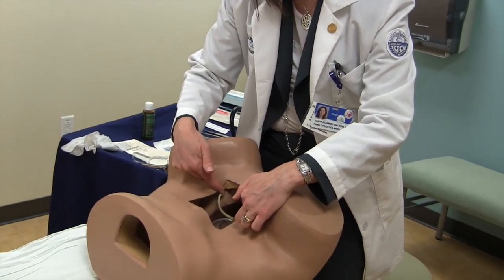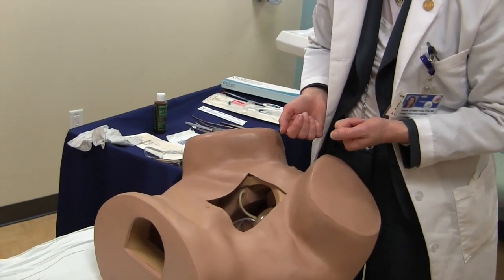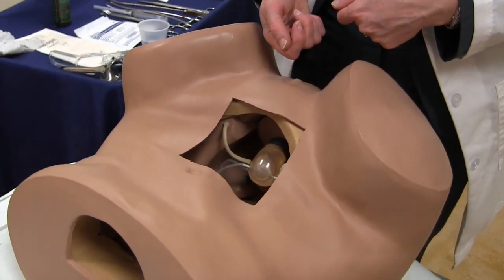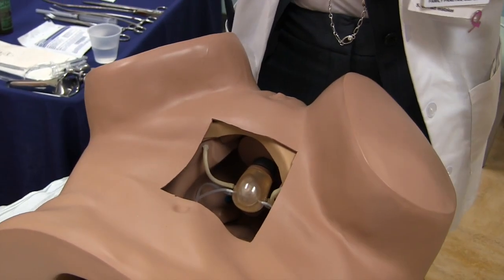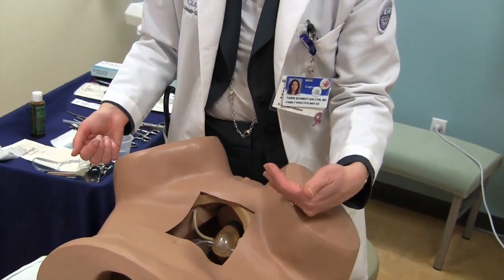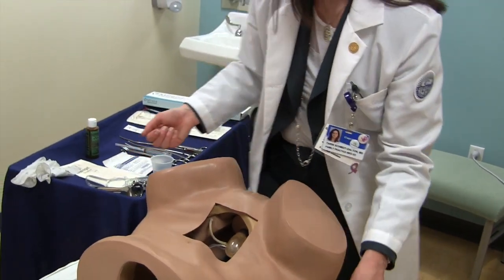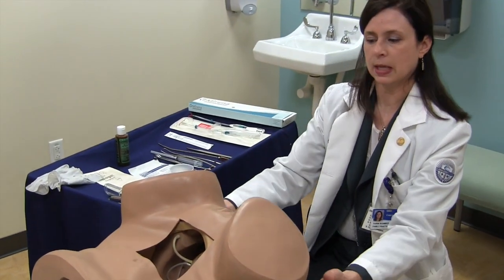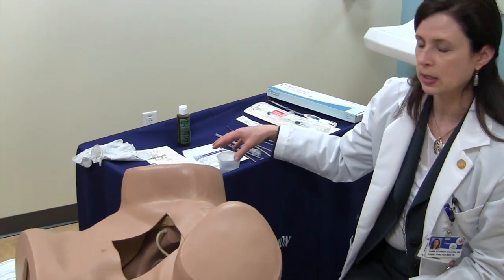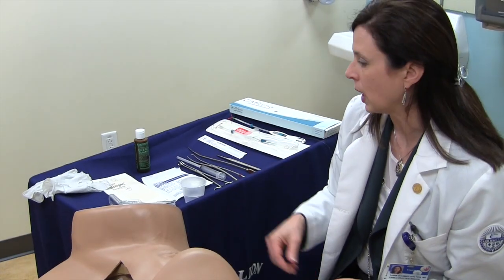Students can then practice their bimanual exam, identifying the location of the uterus. One can also observe the insertion of the IUD and any kind of equipment. Other learners can certainly circle around ZOE, and a faculty member can look over and get an idea if the insertion is at the proper location. With this particular model the skin is fairly fragile. It's important to make sure that one uses either a lukewarm soapy water or a water-based lubricant.